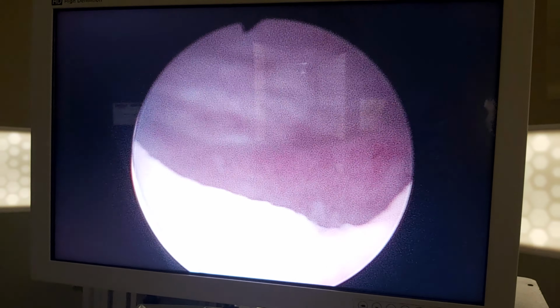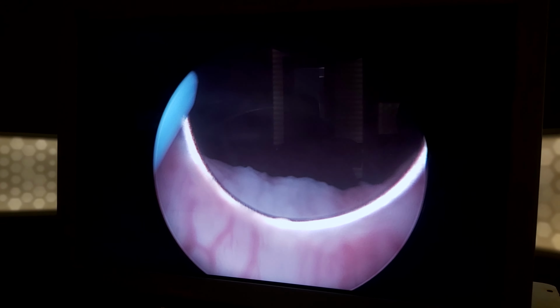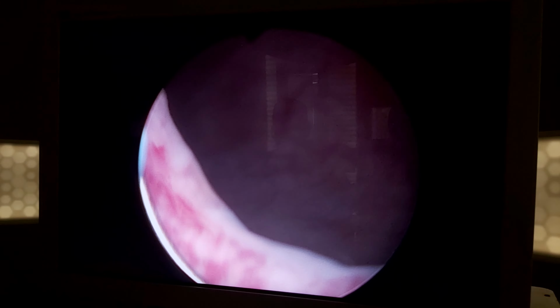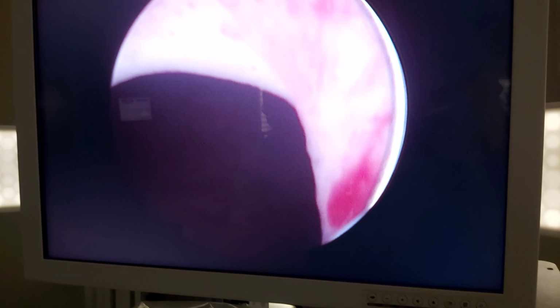So I have to heal these tissues. They come to the bladder neck. I have to stop here, and urethra. Okay, here some tissues also, and in the upper part it seems normal. The rest of the urethra seems normal. Okay, pause. Good.